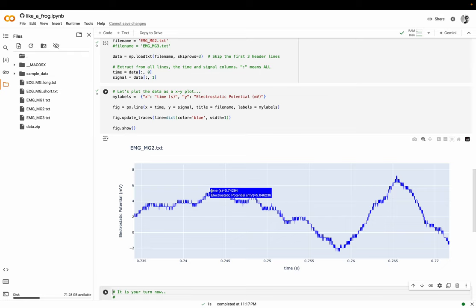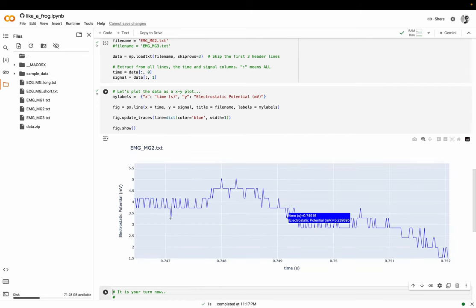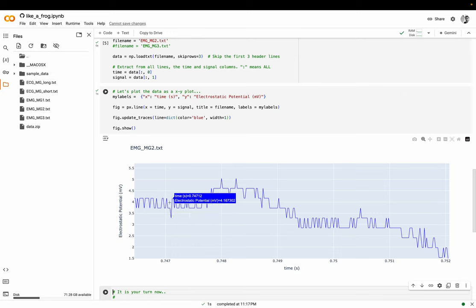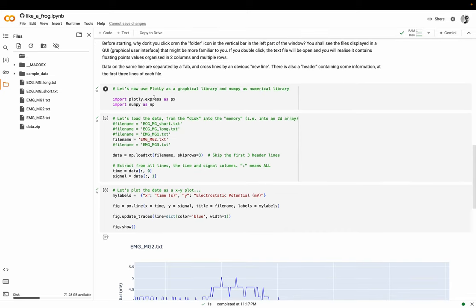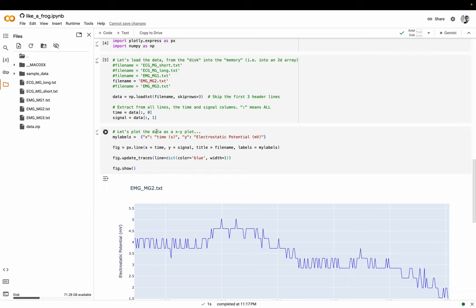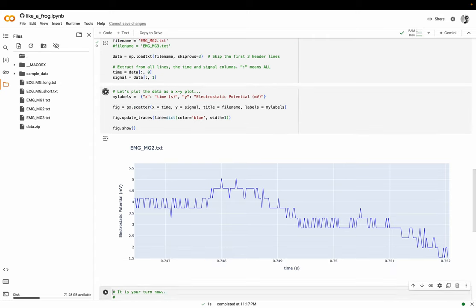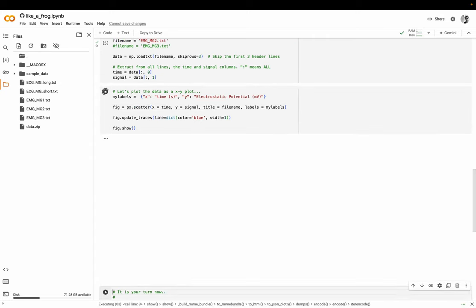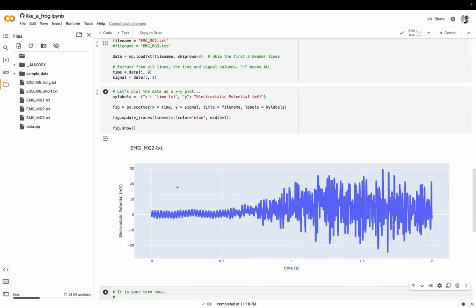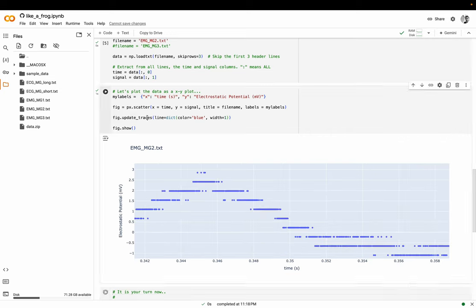It seems that it's technically digitized. It seems that you have only an integer number of levels of millivolts where the trace can be. The more I zoom, the more I realize that you can be here, you can be here, but not in between. It seems you cannot be in between. Another thing that I could try - I would Google this plotly express library that I didn't know before half an hour ago. I found it has the simplest syntax. I can probably see whether scatter exists, and scatter presumably will not connect things by a line. If I zoom in, I don't like it. Then okay, I will put back a line.